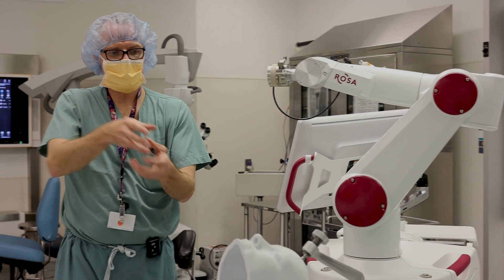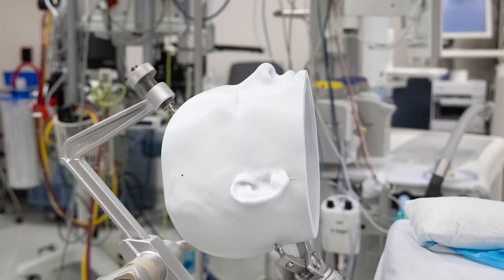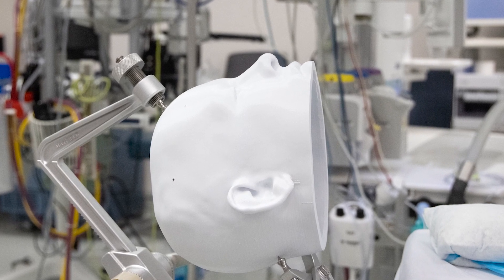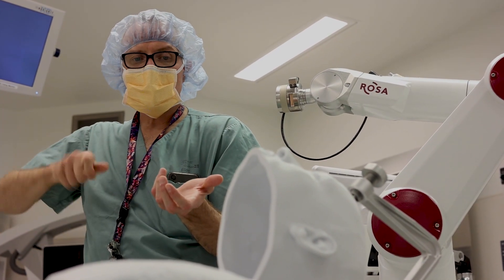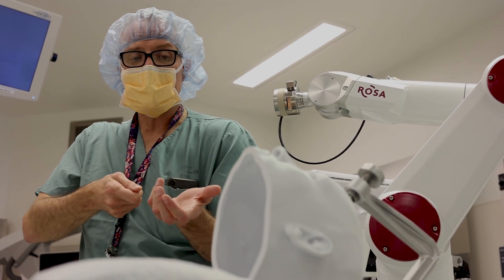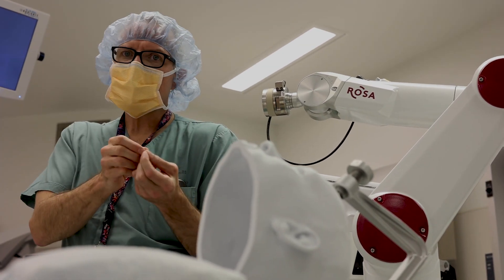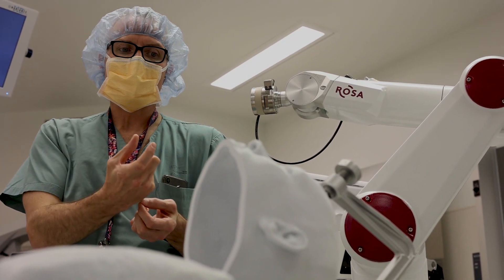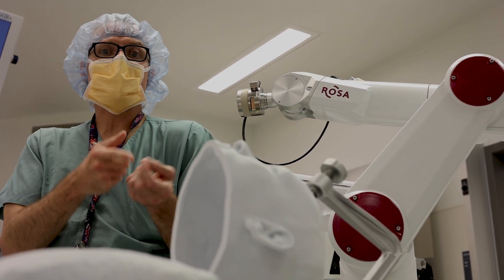Once Rosa's arm comes into the head and is holding that trajectory, we're basically using the arm and the tiny hole in the middle of the arm — it's like a barrel. Then we would take out the drill and we would screw in what we call an anchoring bolt, about two and a half centimeters long. That's fixed — it gets a strong purchase in the bone. It's fixed in the bone, very solid, and that becomes the stereotaxy device.